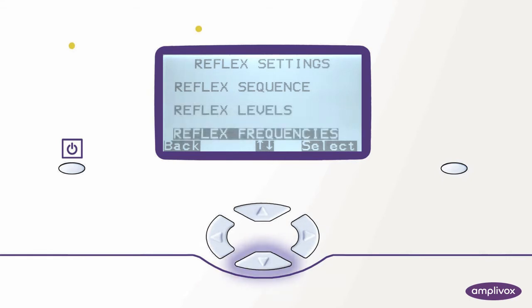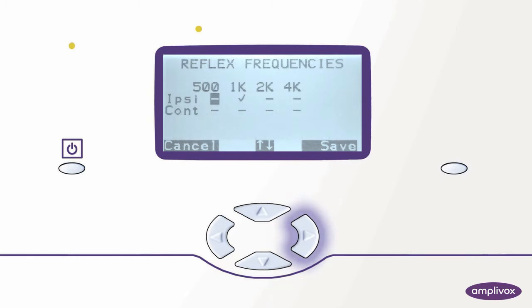We are now ready to set up the frequencies we would like to test. The screen in front of us allows us to see which frequencies are currently active and being tested in a reflex session. Currently we have only one frequency being switched on at 1 kHz.